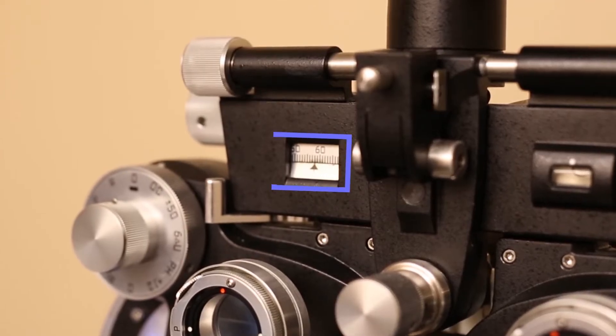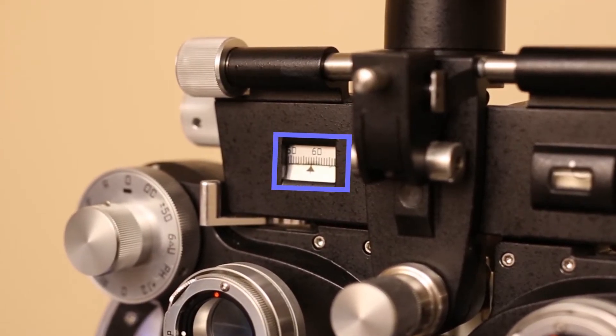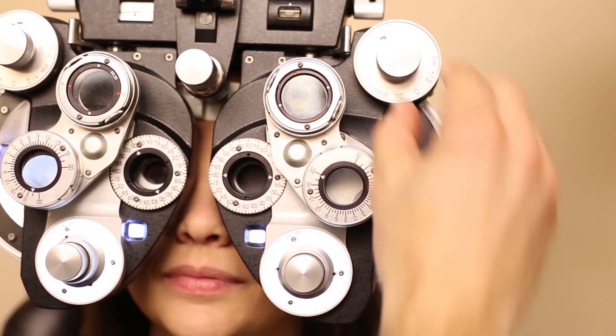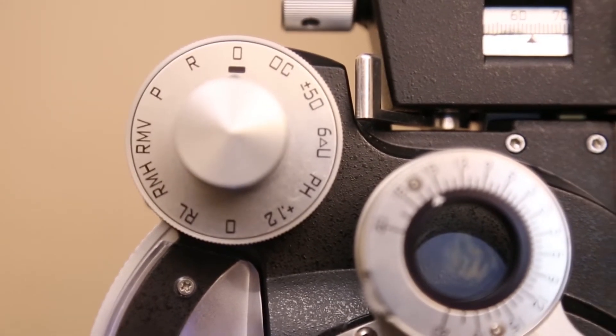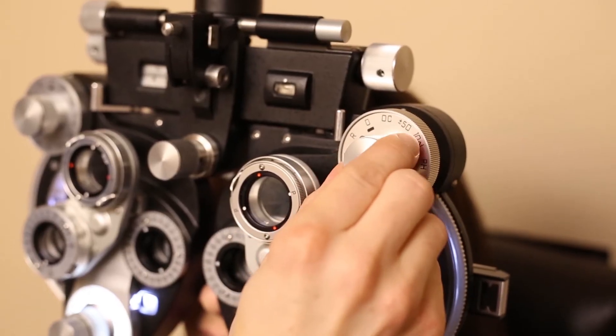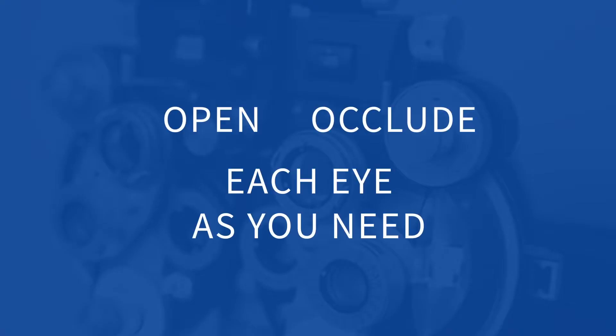The IPD will usually be a number between 55 and 65 millimeters. We're only checking one eye at a time, so you'll have to occlude the other. This dial has a setting marked OC for occlude. Almost the only thing you'll ever use this dial for is to open it or to close it — that's open or occlude each eye as you need.